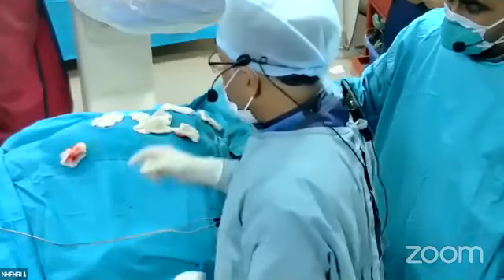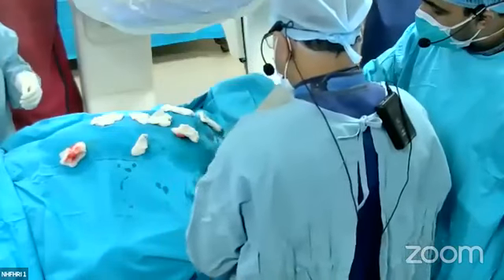The next ECG question for the students, this is commonly asked: which side will you do the pacemaker, right side or left side? What is the advantage and disadvantage of doing the pacemaker on the right side and on the left side? This is commonly asked in the question, I think so. So Professor Mohsin, whether left or right?